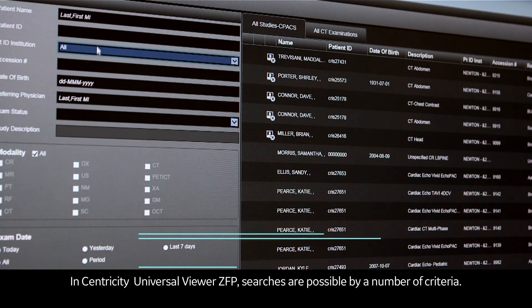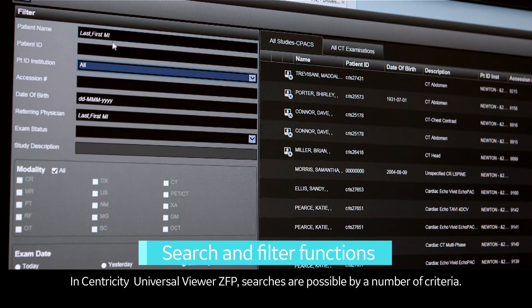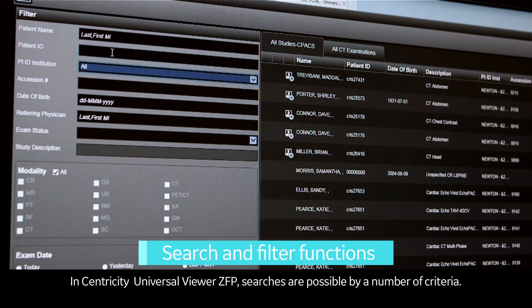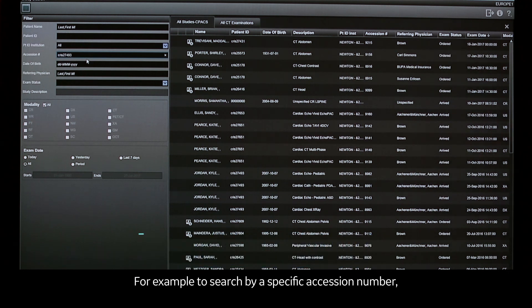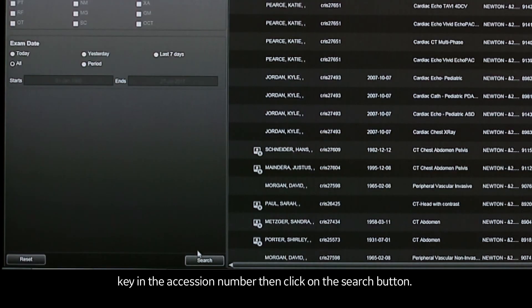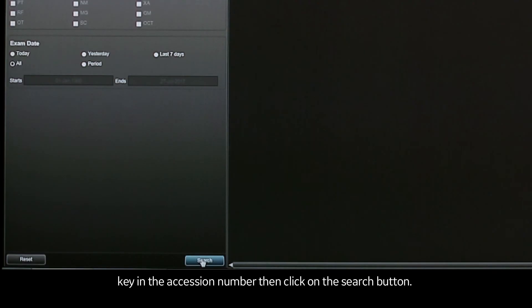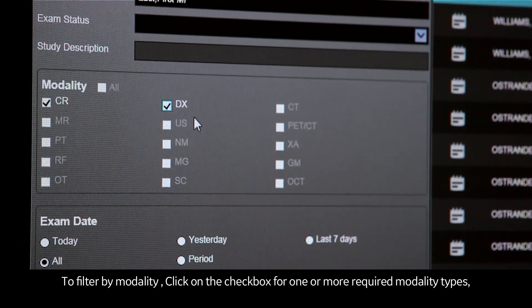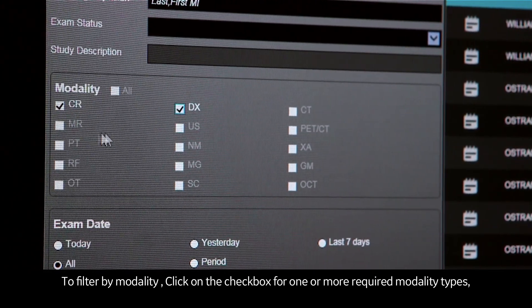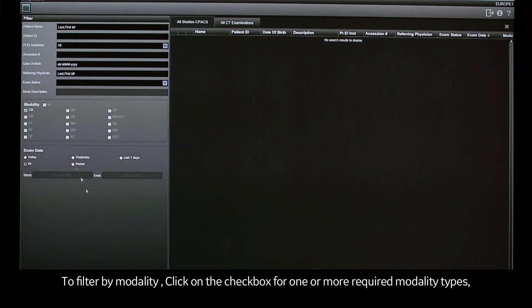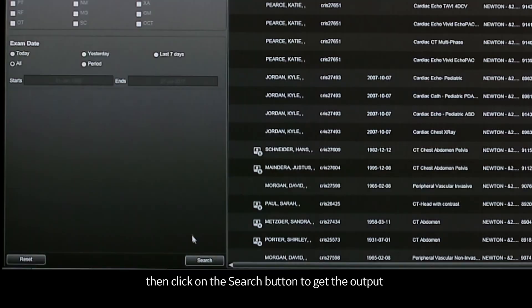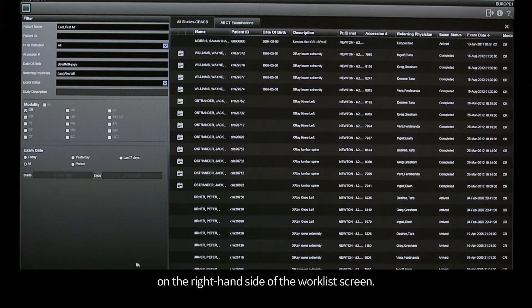In Centricity Universal Viewer ZFP, searches are possible by a number of criteria. For example, to search by a specific accession number, key in the accession number then click on the search button. To filter by modality, click on the check box for one or more required modality types, then click on the search button to get the output on the right-hand side of the work list screen.